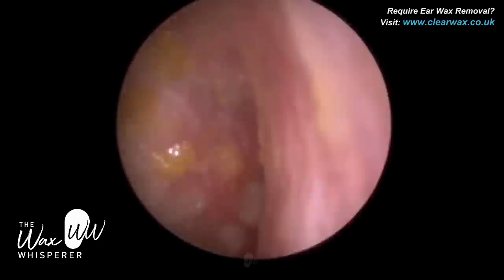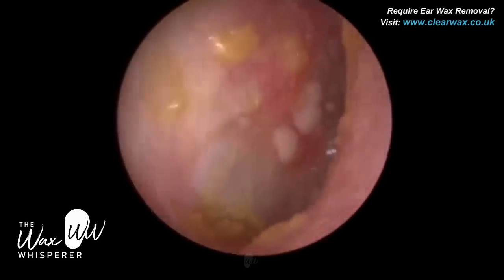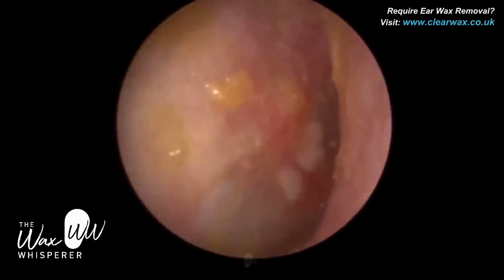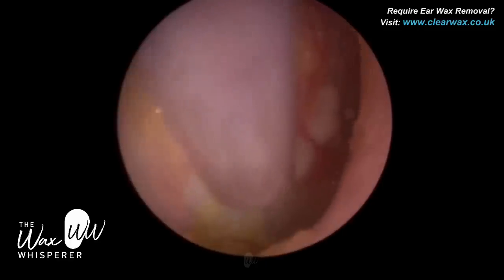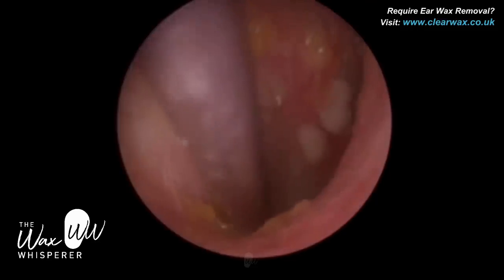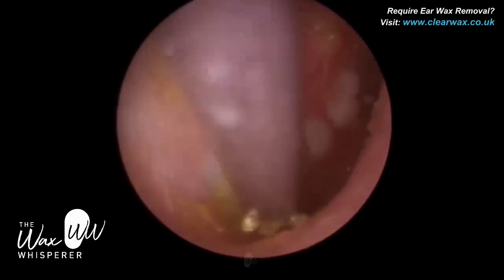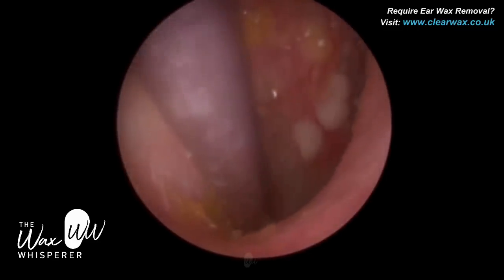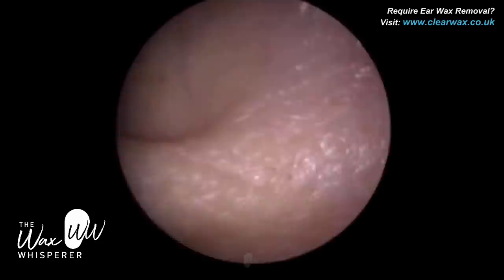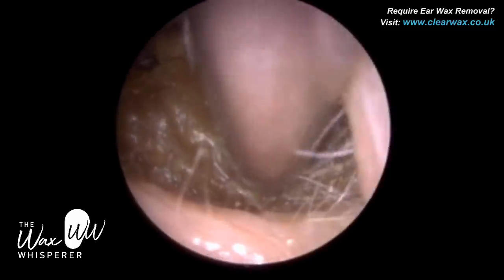The eardrum is now fully visible and it's all intact. There's some wrinkled dead skin on the eardrum. The eardrum has three membranes: the outermost membrane facing us — the lateral membrane — is the same skin that lines the inner two-thirds of the ear canal, less than 0.1 millimetres in thickness. The middle layer is a fibrous layer with connective tissue. And then the innermost layer, which we can't see, we call the middle mucosa membrane — mucosa being a membrane that secretes mucus.